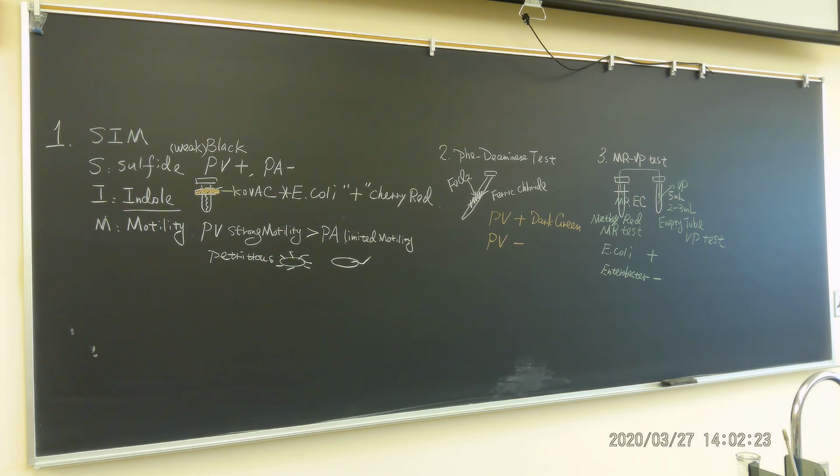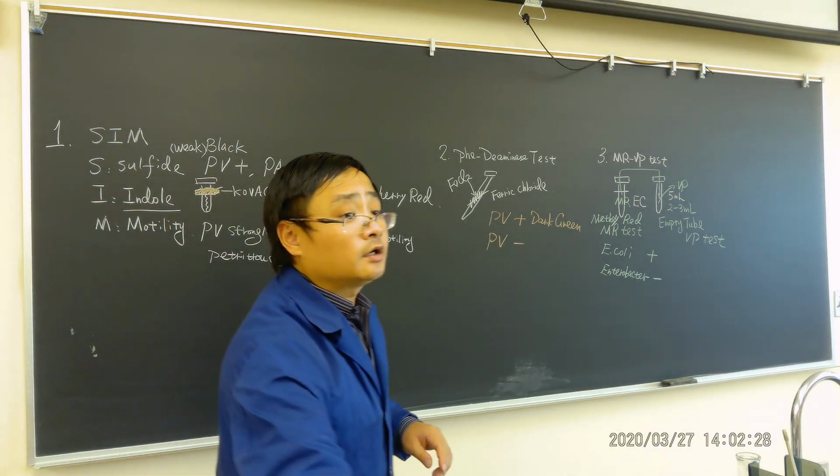So Rachel will add reagent B. Then you shake it. You may not see anything right now.